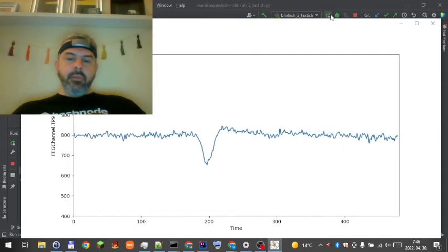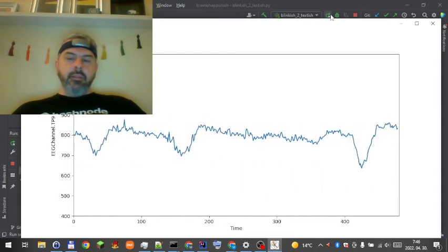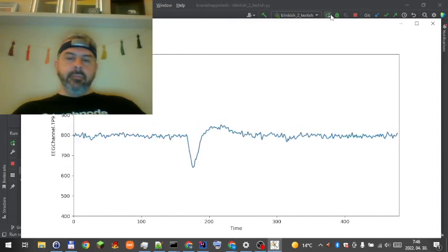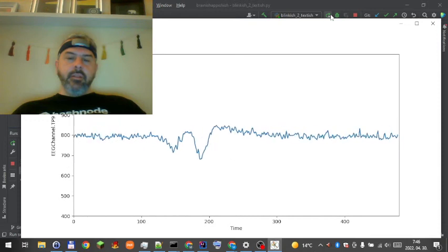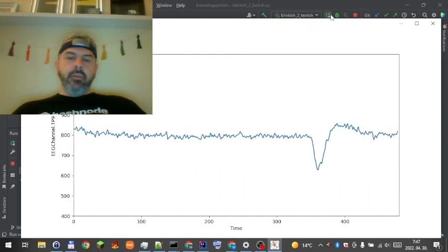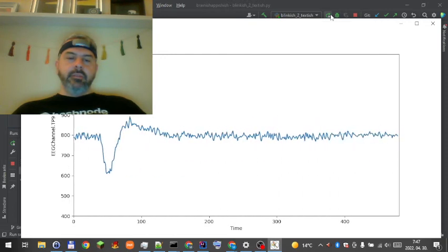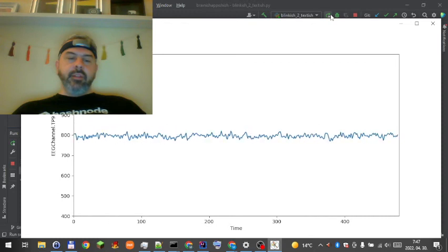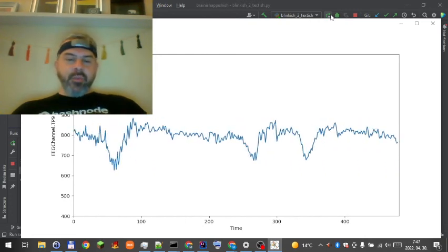Okay, then let's check when will we say the signal has ended. Well, the normal signal, it's not that easy, because it's visible that it's overshooting, but not much. So I guess we have to say something like 820. Of course, it's a very, very simple algorithm. This is the first version. I can imagine much more sophisticated versions.